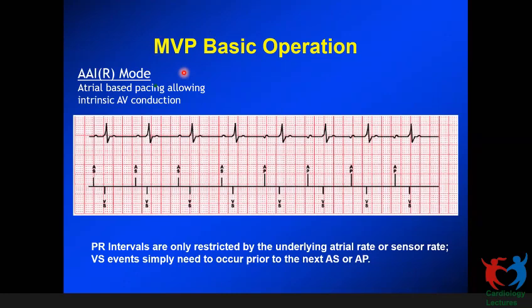In the conventional pacemaker, you cannot program an AV interval beyond a certain limit. Then if you program it that way, if the patient goes into an AV block, at a long PR interval, you end up pacing the ventricle that might allow a retrograde ventricular activation, which may predispose the patient to pacemaker mediated tachycardia. So this MVP mode gives the benefit of AAI mode of pacing, but at the same time, when it has to pace the ventricle, it paces at the optimal AV interval. So this is how it behaves.